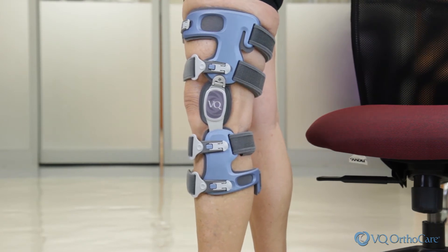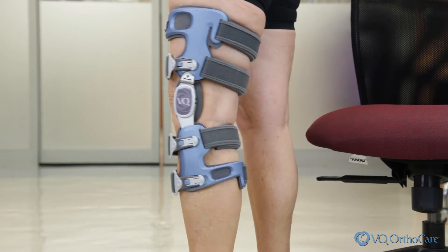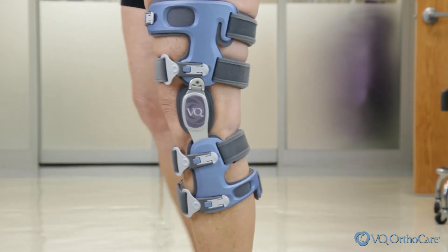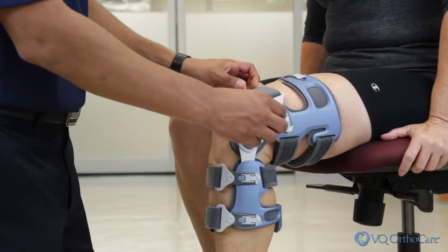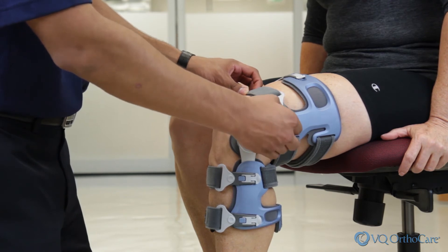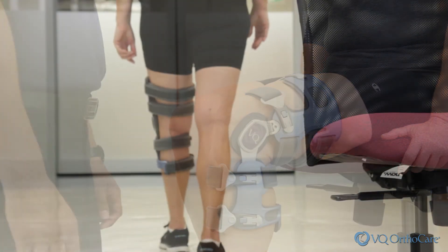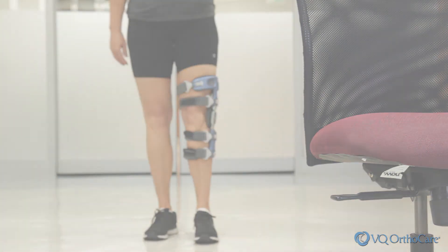Stand and have the patient walk a short distance to ensure comfort and proper correction after each adjustment. If there is any discomfort in the knee joint or leg, turn the angle adjustment back slightly. The patient should only feel a gentle and slight pressure on the knee. If more relief is required, turn the Q-Hinge screw no more than an additional eighth of a turn. Walk after the adjustment and check again. Over adjusting the Q-Hinge may cause discomfort, rotation, or skin pressure issues. Always adjust conservatively.